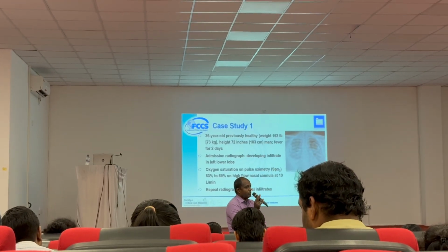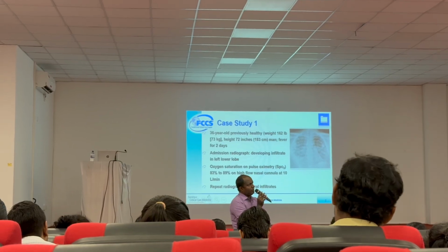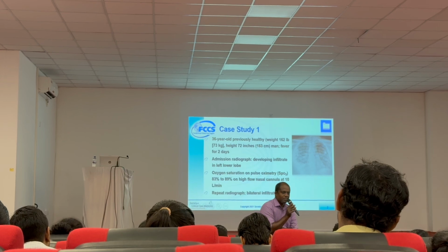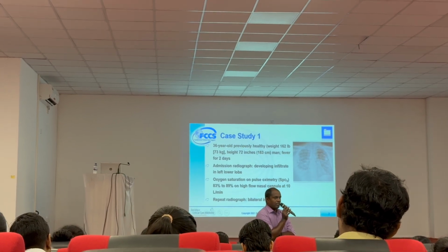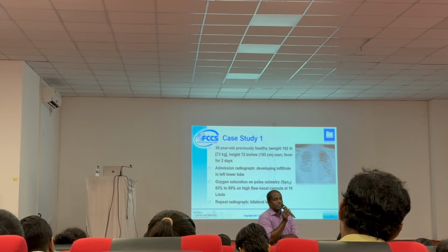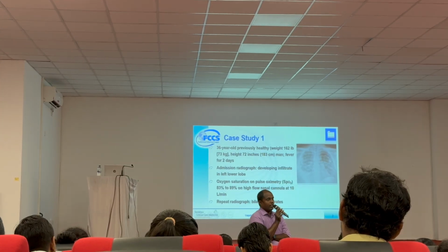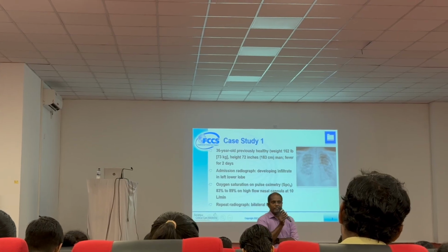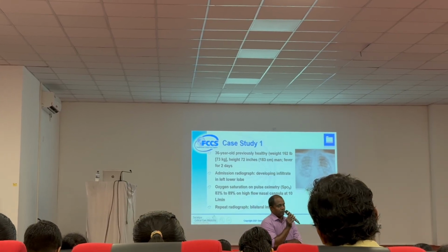How much tidal volume you are giving matters. How are the airway pressure and the tidal volume related? Even in physiological breathing, they are related: the more tidal volume, the more pressure you need.